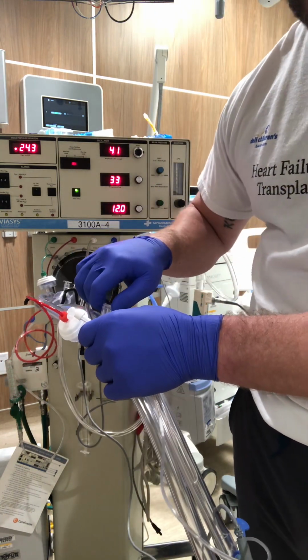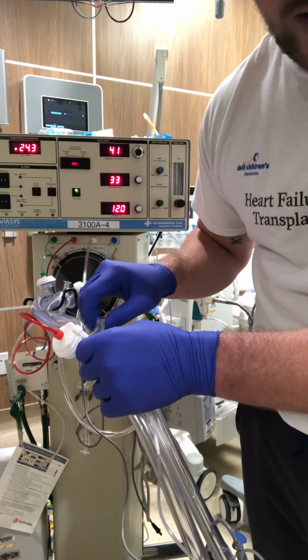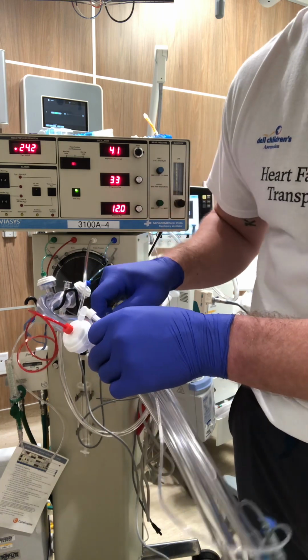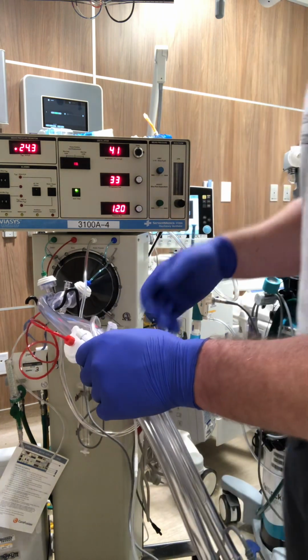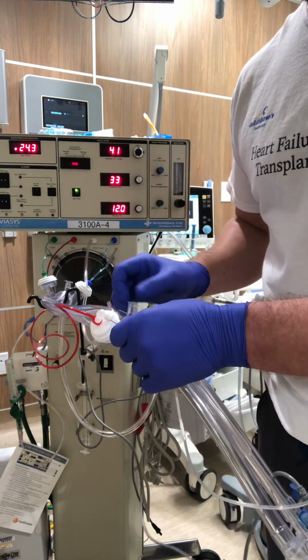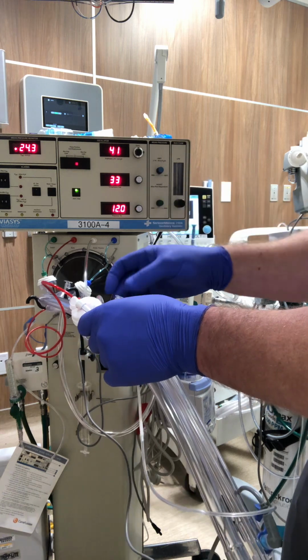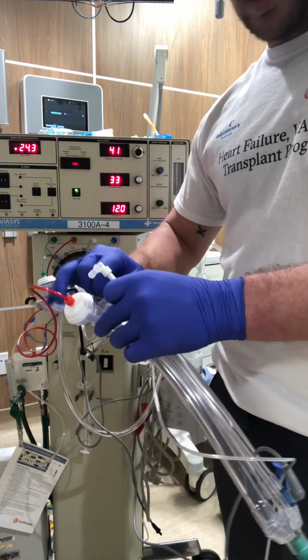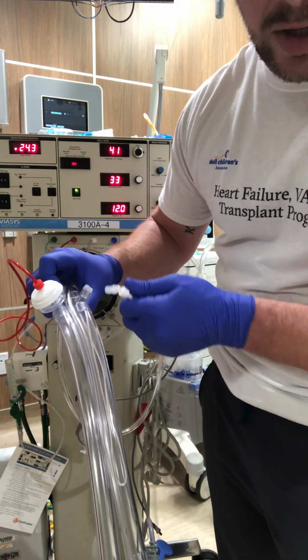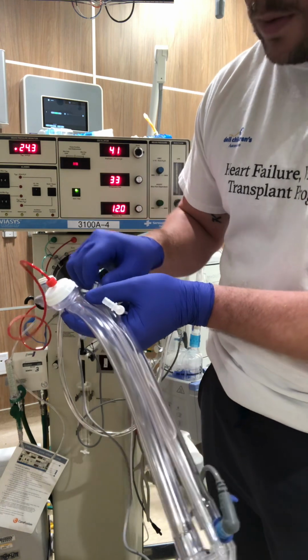Same thing, I expect my low pressure alarm to start alarming, and if I'm not quick enough with adding this sample line to it, I expect my oscillator to shut off. But like we just said, it's a very quick fix. Holding down the reset power fail button for about 2 seconds will repressurize the system and turn your oscillator back on automatically, okay? So let's do it. Typically you can be quick enough to where it doesn't shut off, but I'm going to make it shut off on purpose so that we can see again how to fix it.